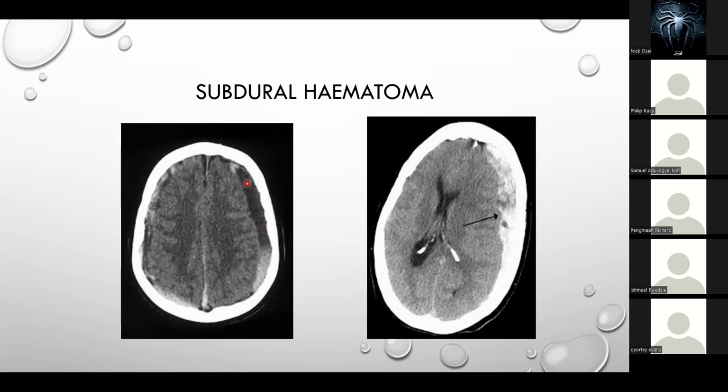Can you see? So this is a chronic bleed into the subdural space, and there's an acute one. So this picture is more of an acute on chronic subdural hematoma. Compared to the one on the right, where the bleed here is white, this means that there's an acute subdural hematoma. The bleeding has just occurred.